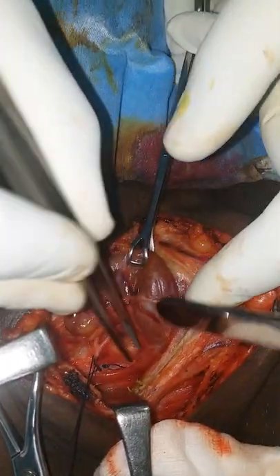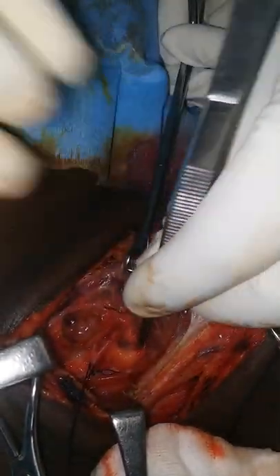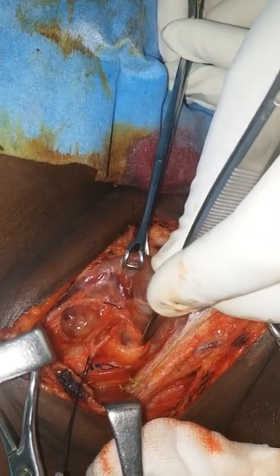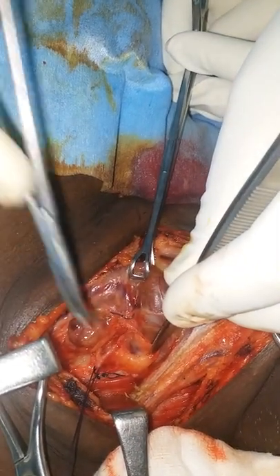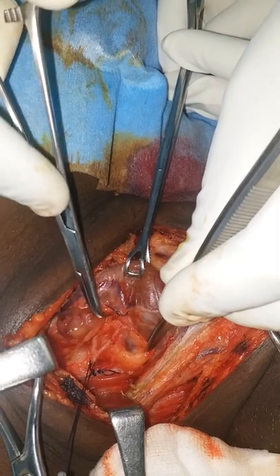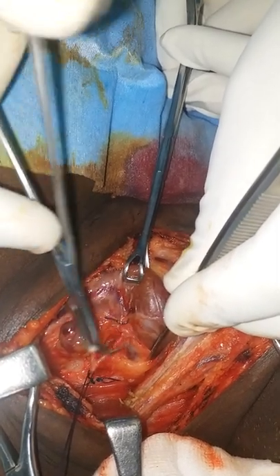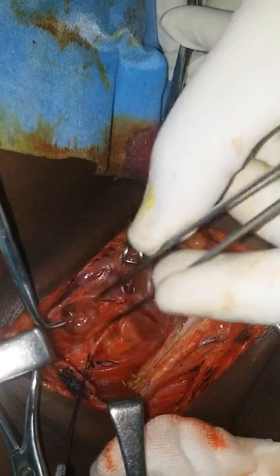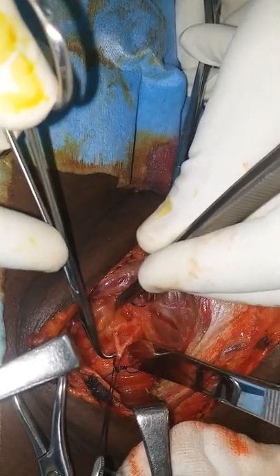This has to be demonstrated that both these tissues are receiving vascularity from the inferior thyroid artery, which only confirms that the pathology that they have handled is this. You can see this is the vascularity going to the gland this side and this is the vascularity going to the gland this side.